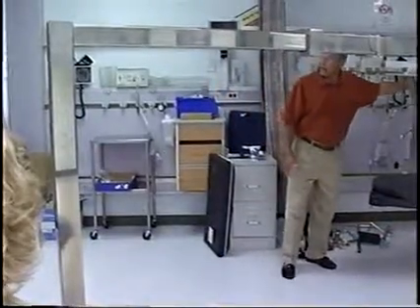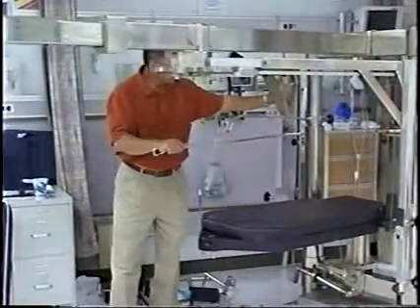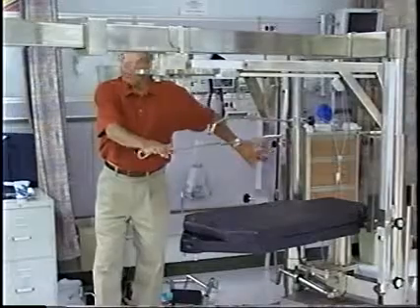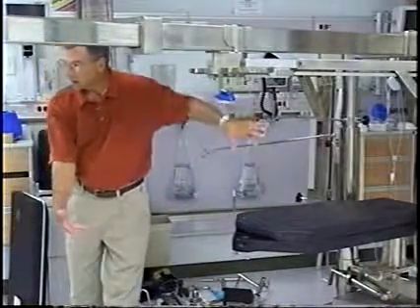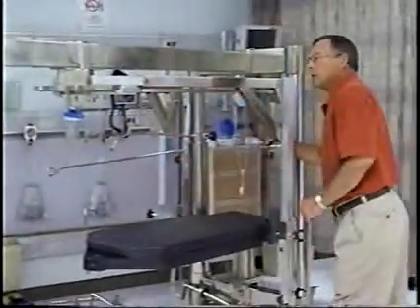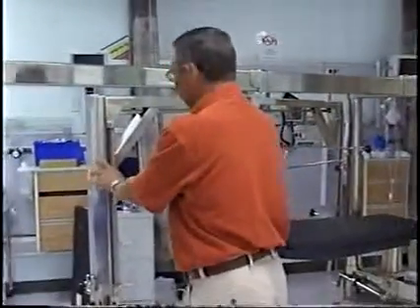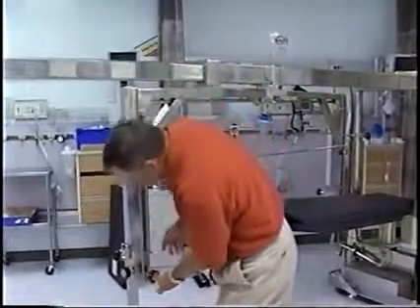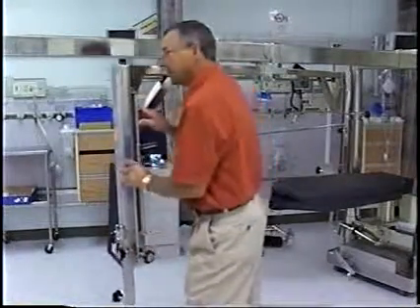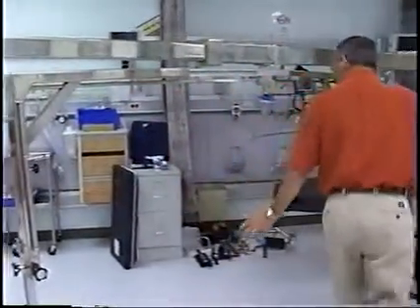If we know it's going to be a left hip, then we can just leave this spar, if you will, this contraption down here, out of the way, because the C-arm is going to be coming in from this side. All right? So once we know it's going to be the left hip, and we know we're going to be pulling traction from the left side, this will swing out. There's a knob down here that says lengthen and shorten. That should be loosened and pulled out all the way, because we're going to be bringing the patient in from this side.